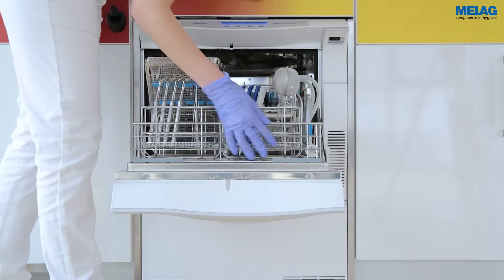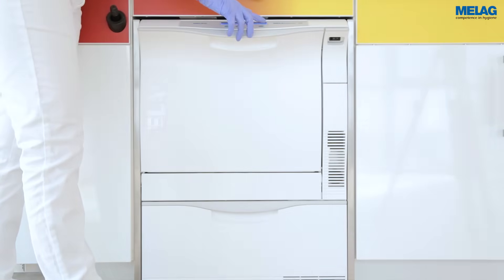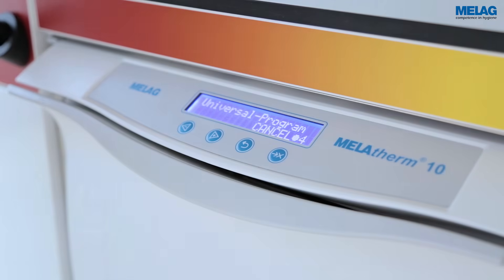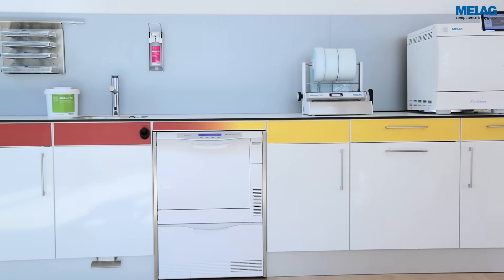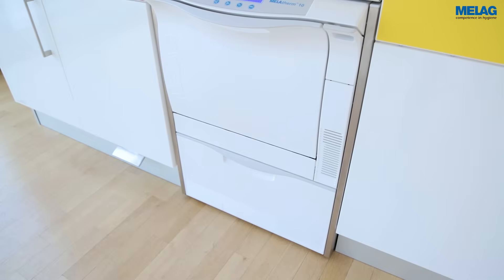With a short operating time of 37 minutes and subsequent integrated drying, the MeLag Therm 10 provides extremely quick instrument availability. The process agents developed especially for MeLag Therm 10 guarantee optimal cleaning results in conjunction with economical consumption.